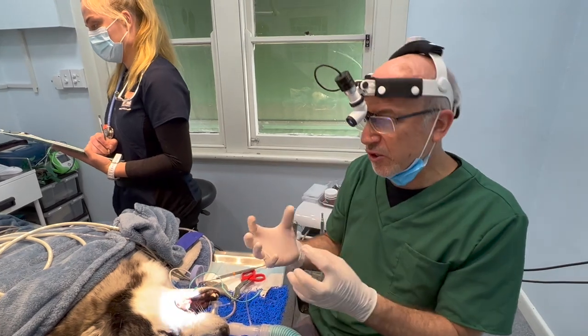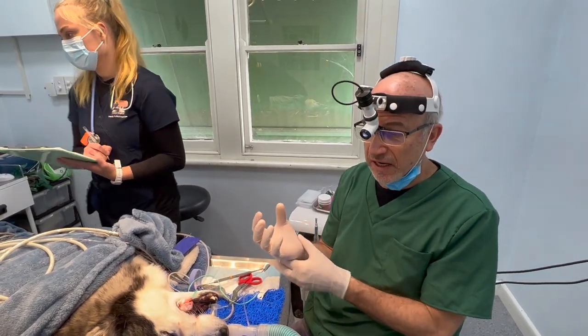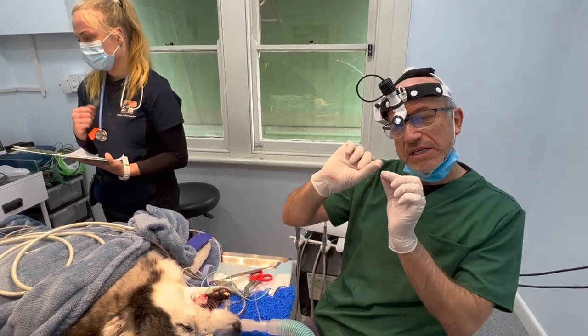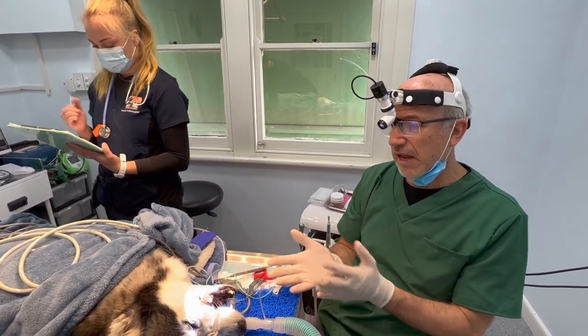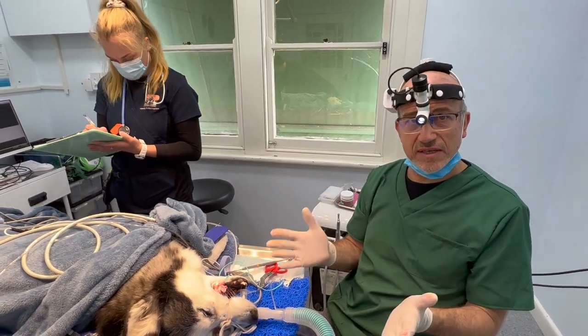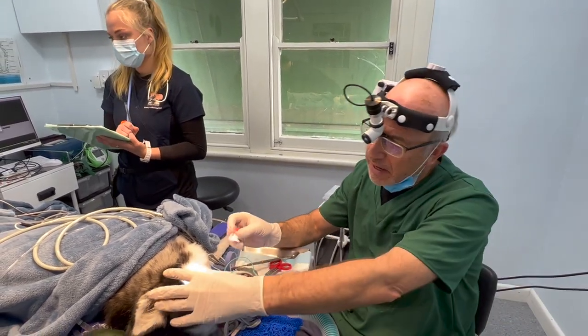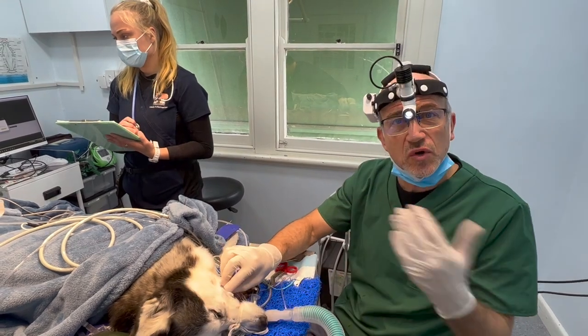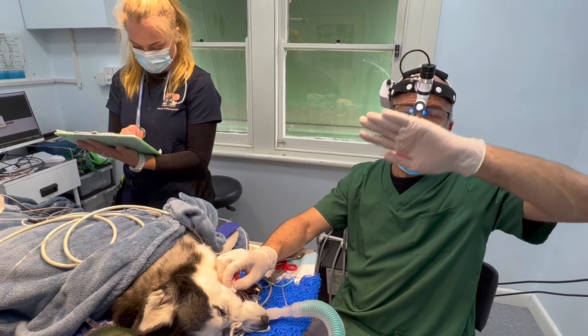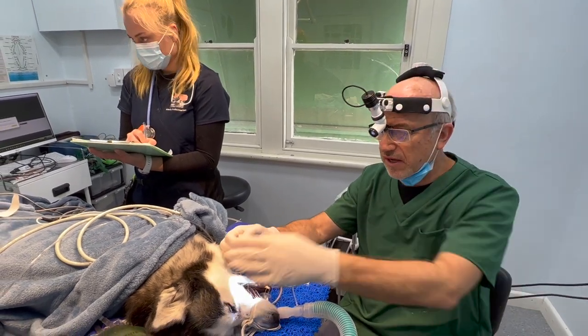When you get a really big tooth in a big dog like this — it's 20 kilos, massive teeth — it's a three-rooted tooth. He's got a slab fracture; in other words, a piece of tooth has come off, it's in the gum, and he'll have continual pain and periodontal disease. So are we extracting it? It should be complete resolution. We do try and save teeth, but this is not a case, because the slab — the piece that came off — goes right into the gum.